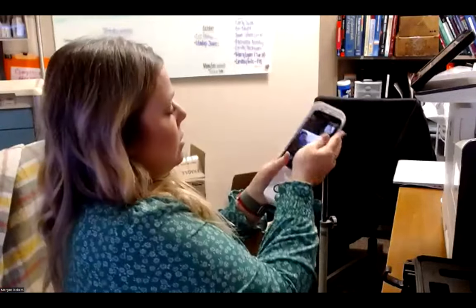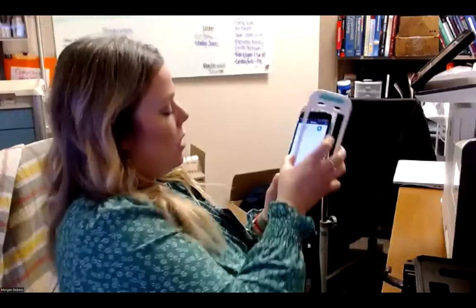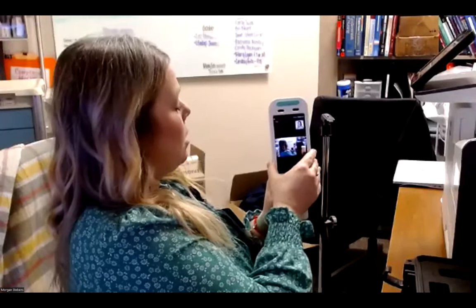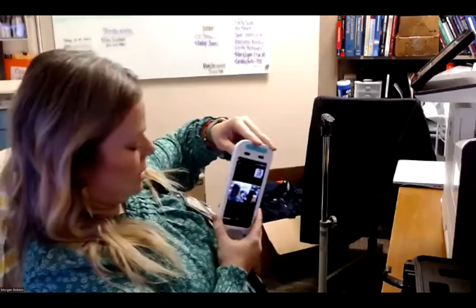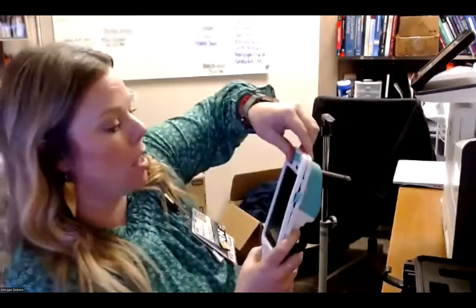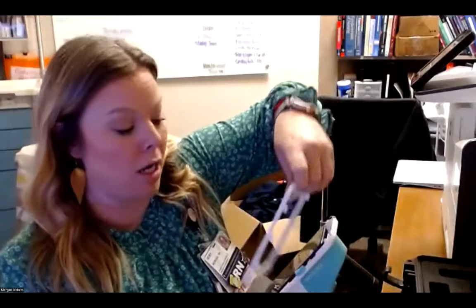What I mean by the other piece is that this piece goes right inside, and then you just slide it in and that's what that looks like. It turns into a colposcope. I will show you what it looks like to change, because you have to change capture modes. That's what that piece of the device is. There's lots of little pieces.